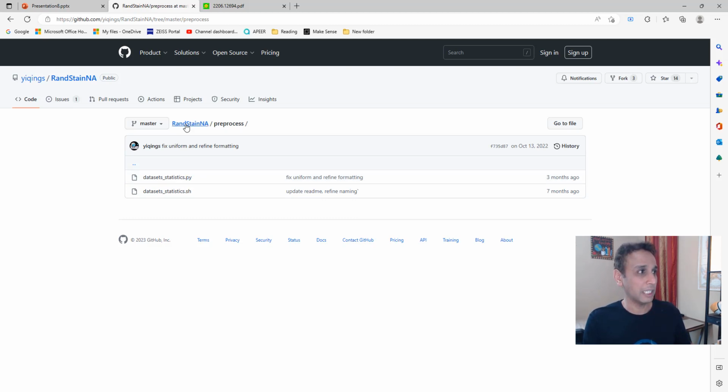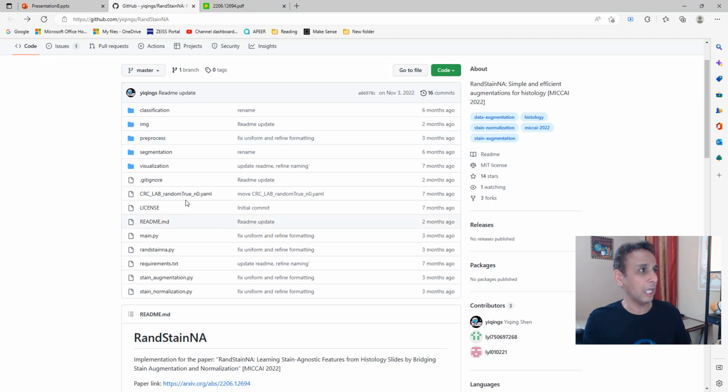I'm going to explain these 3 steps. And I think they also included this classification and segmentation to show you examples of how you can use this as part of an augmentation scheme while you're doing classification and segmentation. But I'm pretty sure most of you know that. I'm just focusing on the technique itself and not just including that as part of augmentation.